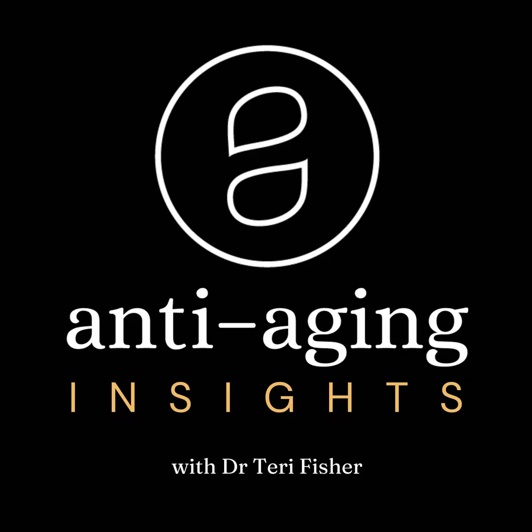of solution. And those are typically the ones that we use, again, for Botox, for neuromodulator treatments, because the units that we're dealing with when it comes to Botox are so small that we want to have these very small syringes because it allows for precise measuring of the volume. You can imagine that if we had a massive syringe, a 10 milliliter syringe, and we were only injecting 0.1 or 0.2 milliliters at a time, it would be very hard to control that in a massive 10 milliliter syringe. But when you have a very small syringe that only holds up to 0.3 milliliters of solution, then when you inject it, you have much more control over how much you are depositing.